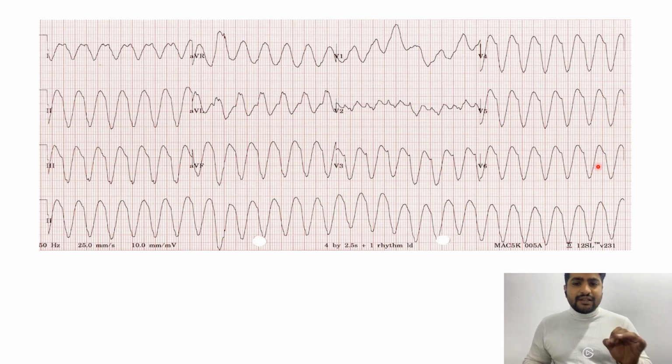There is another term called sustained VT or non-sustained VT. So what is non-sustained VT? Any ventricular tachycardia that starts and ends within 30 seconds is called non-sustained VT. It settles on its own. Any ventricular tachycardia that stays beyond 30 seconds is called sustained VT.